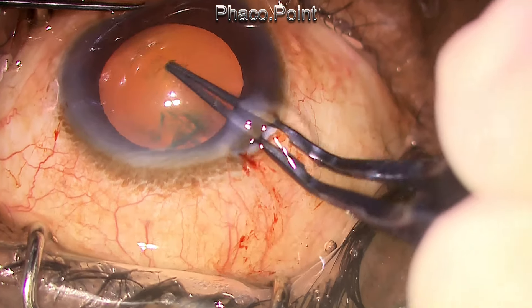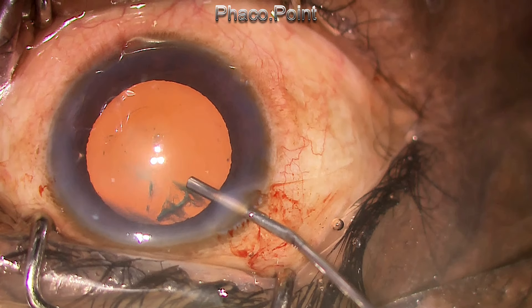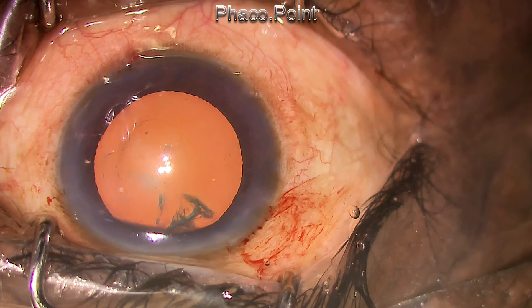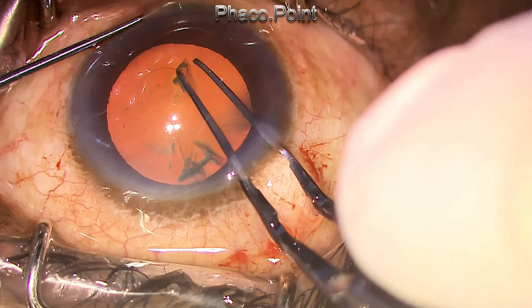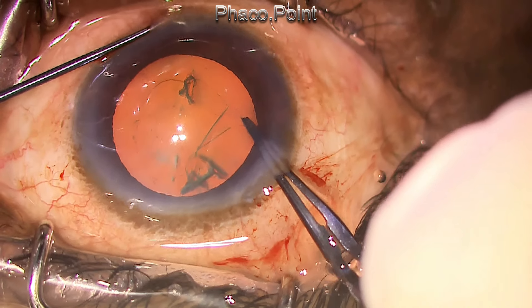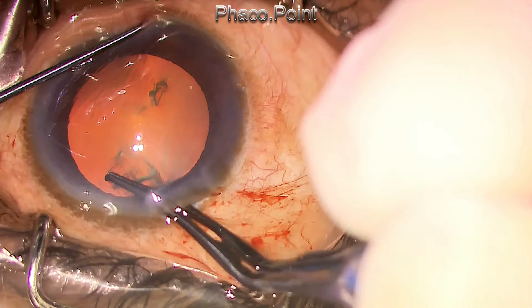This leaves me a small, very oval opening in the anterior capsule which is not enough to complete the case. So another cut is made towards the other end and the capsular rhexis is now completed in a clockwise as opposed to an anti-clockwise fashion.